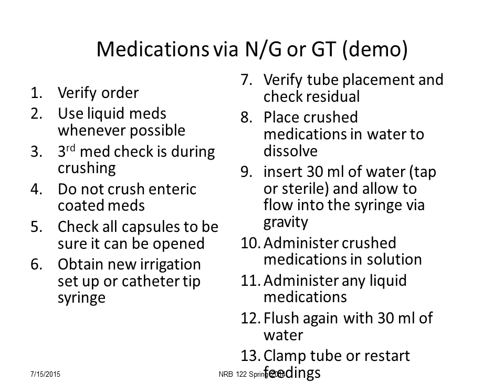Medications via your nasogastric tube will be much clearer when I show you in class, and you're going to be doing this on the unit, and you're going to be doing it with your faculty member. You're never going to be giving medications via a nasogastric tube or a gastrostomy tube independently while you're in nursing school. Remember, the same rules apply as for any medication. We're always verifying the order, we're always identifying our patient, we're always making sure that we're not crushing meds that shouldn't be crushed, and we're giving meds appropriately via a tube.